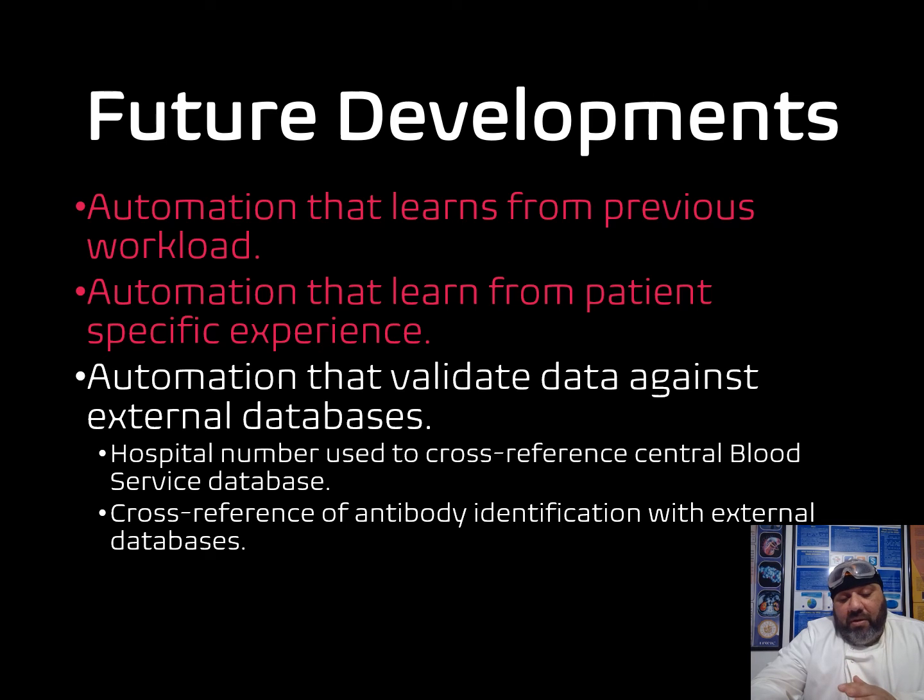when samples or specimens relating to particular complex investigations are labeled, then sent away for additional serology, at least where transfusion practices are concerned, then generally at the larger laboratories there is separate ID and information that is used specific to serology. And so automation that validates with, and aside or aligned to, external databases is yet to be envisaged in a more integrated way.